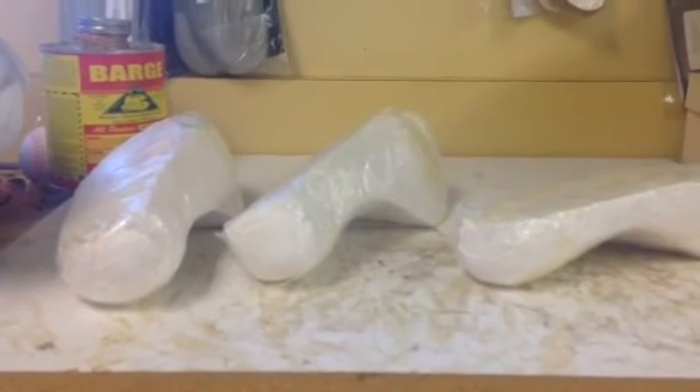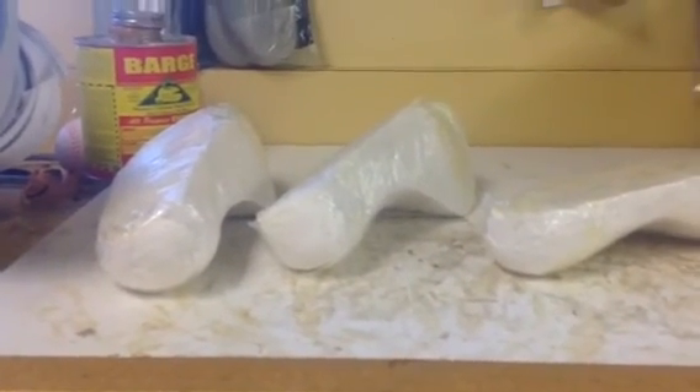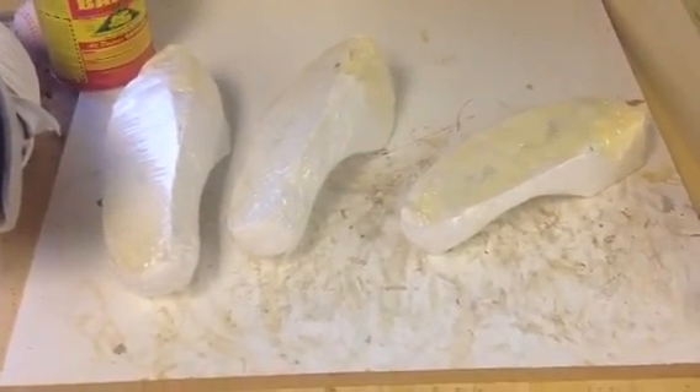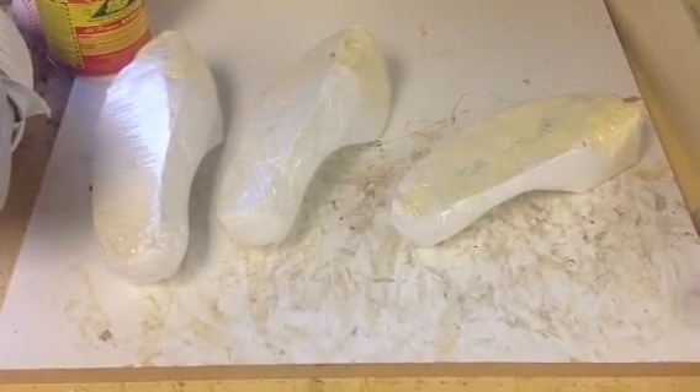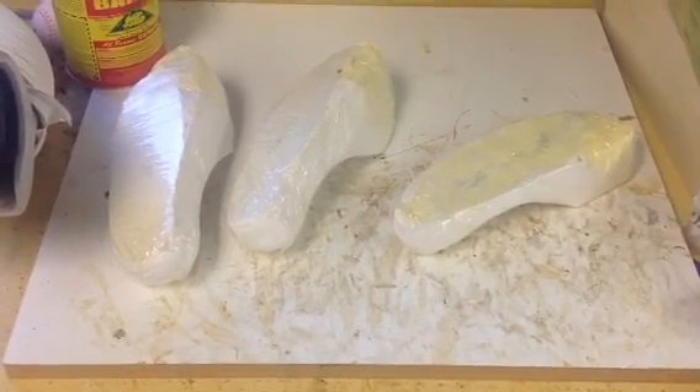I hope this helps you understand the various corrections. We've presented seven different corrections that help with the varying degrees of forefoot varus feet that present to our office with pronation symptoms.